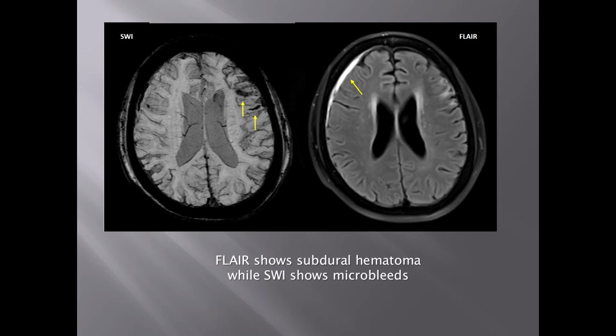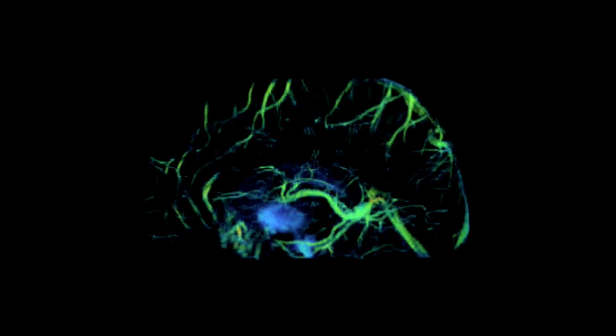My point here is that I think we've missed the boat not doing perfusion imaging with traumatic brain injury, and we may find that there's a very strong correlation with these changes in SWI and perfusion.